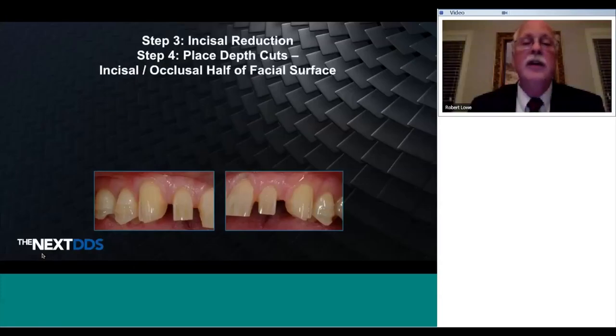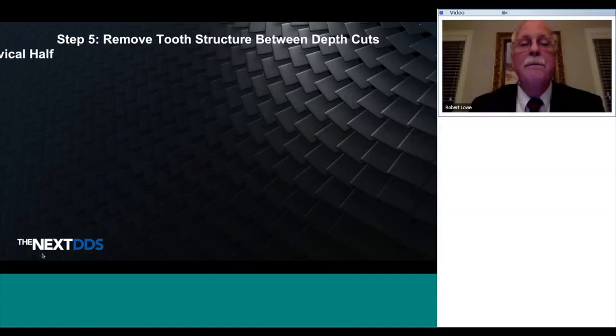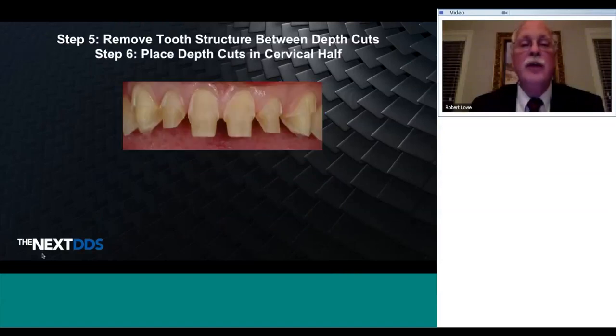Do the incisal reduction, and then do the depth cuts on the facial half, first, or the incisal half first on the facial. Remove the structure between the depth cuts. Place the depth cuts in the cervical. I like these views because you see the teeth in half preparation. You can see how the tooth preparation is following the natural anatomy of the unprepared tooth because that particular finish line is uniform in thickness.